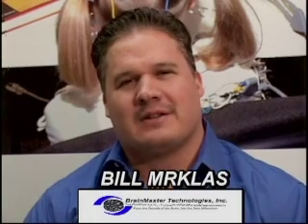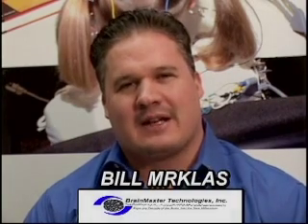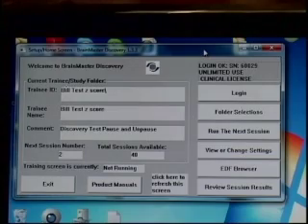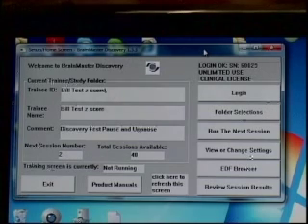Hello, this is Bill Merkless from BrainMaster Technology. Today we're going to run through the instructions on how to run a z-score training on the Discovery 24e. What we'll look at is how do we create a folder, choose a settings file, and run the session, entering it as a new client and bringing in a new settings file.